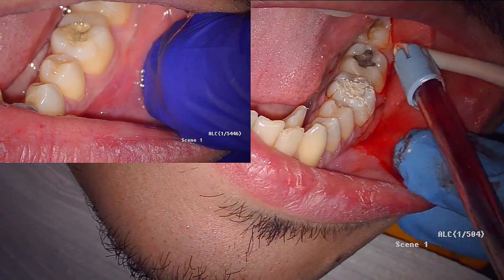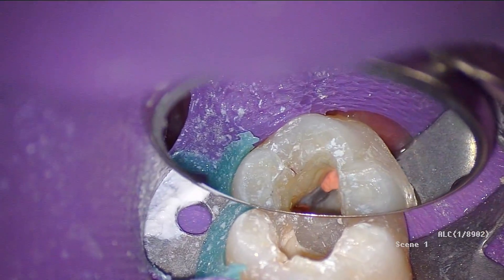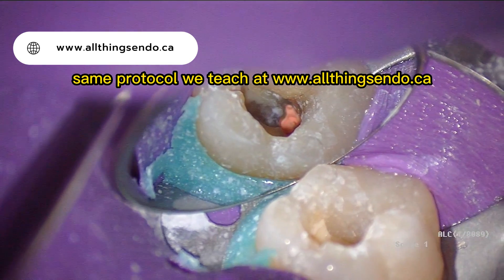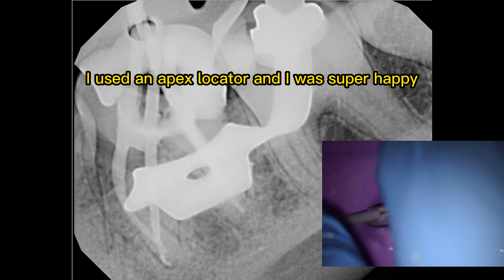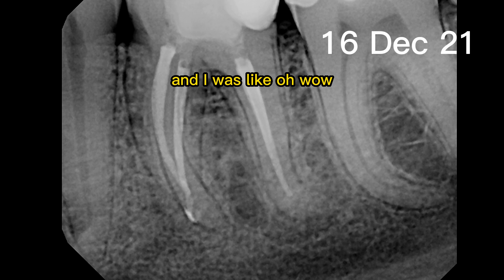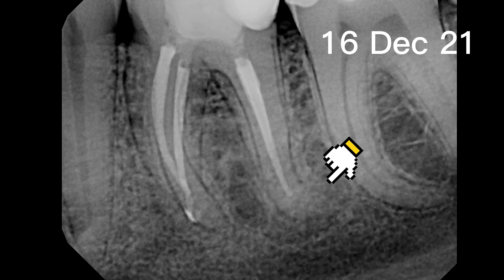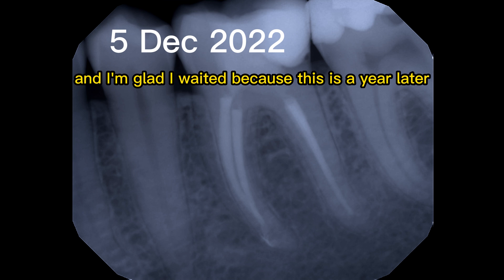We'll bring the patient back in two weeks to finish the case. I was really worried about whether this case would be successful. At the second appointment two weeks later — using the same protocol we teach at allthingsendo.ca — I took a working length radiograph and it looked good with the apex locator. But then I looked at the final periapical radiograph and noticed we were a little short: greater than two millimeters from the radiographic apex on the mesials, plus a little hook on the distal. So I wanted to wait before posting.